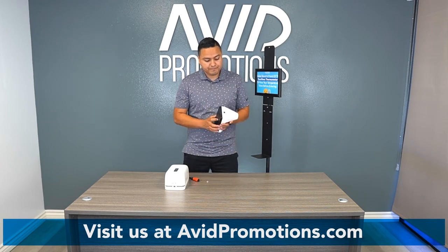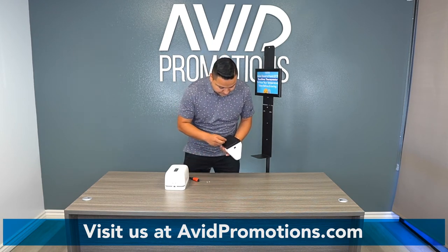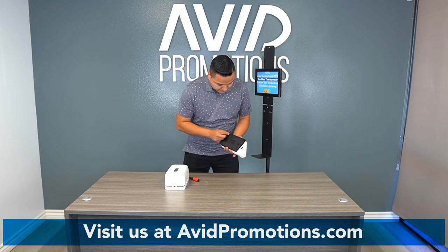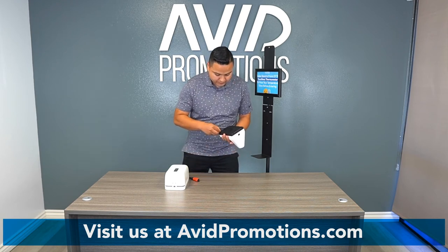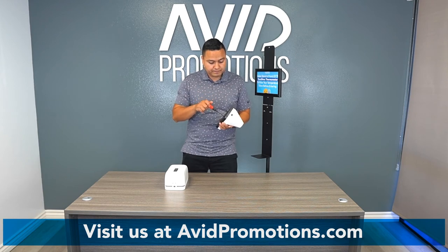Once we're done with that, let's put this thing back together. You're going to use a Phillips screwdriver and put the screws right back in.